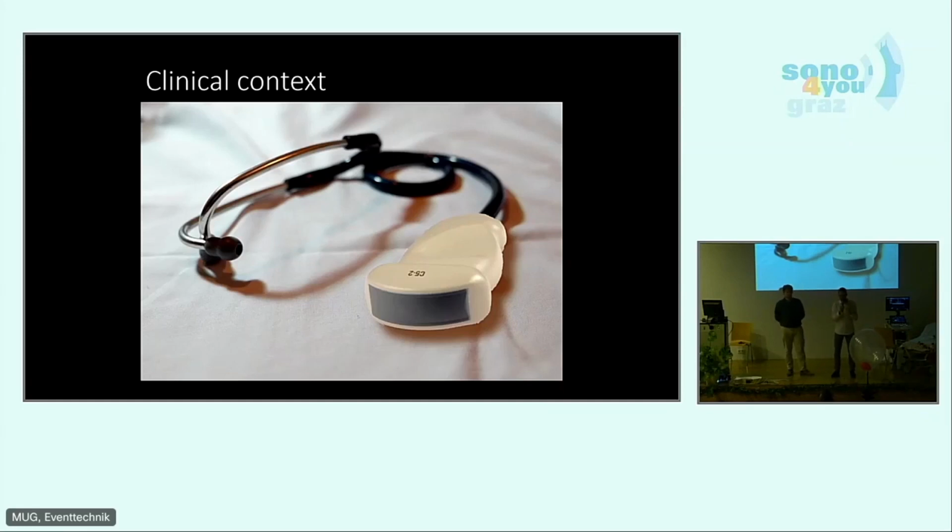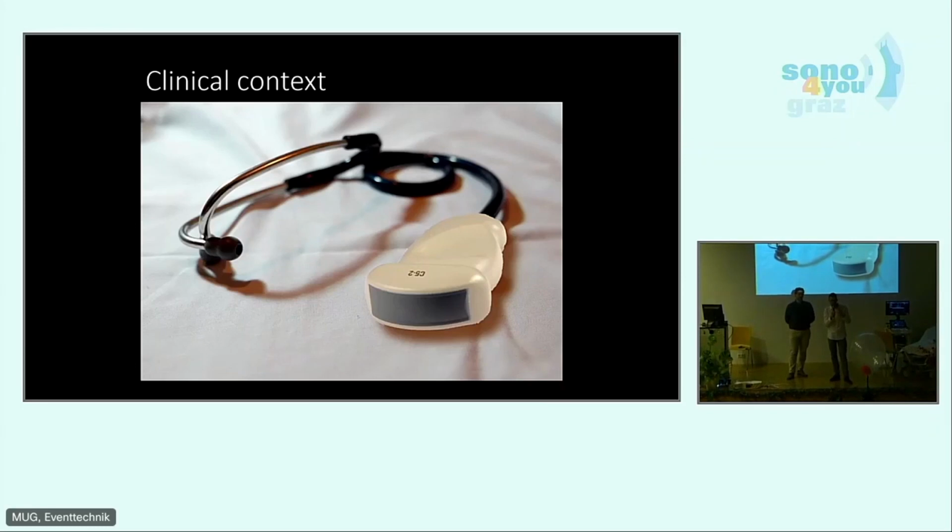the most important thing is to do a lot of scans in healthy individuals and really understand the anatomy and physiologic cut sections. But when you do your first approaches in a clinical setting, which also will be very soon, you should at the beginning cope with easy questions that you ideally can answer with a yes or no.